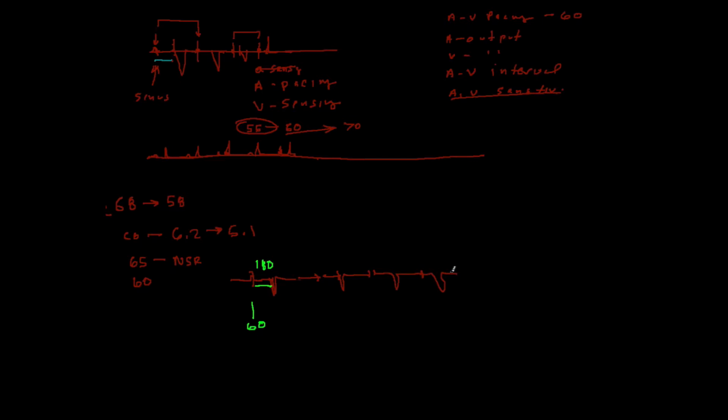Well, there's no right answer, but one thing you can do is ask, what is the patient's underlying rhythm and rate? And so when you go ahead and just pop those little connectors out of the top of the pacing box, you see that the patient has some AV block, but their native heart rate is around 56.